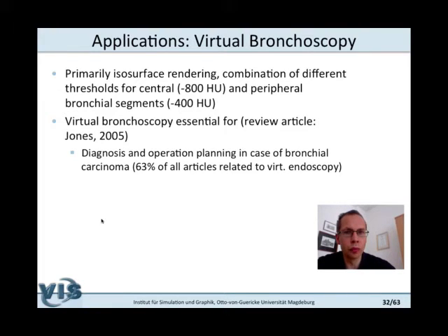Let me make a few remarks also on virtual bronchoscopy, and again, instead of commenting on a certain individual publication or a small selection of them, I refer to a review article, a kind of survey article that summarizes how virtual bronchoscopy is actually used in clinical practice. That means in particular for which type of diagnostic and therapeutic questions it is used. So one first statement is that virtual bronchoscopy typically uses surface rendering as major rendering mode.